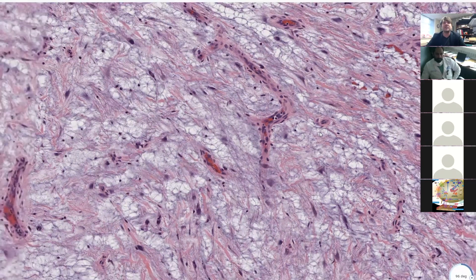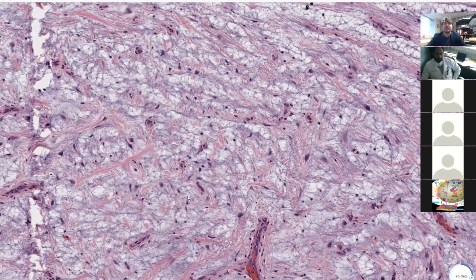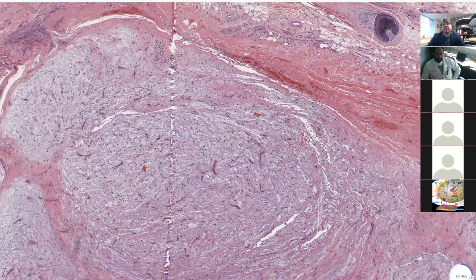But basically, the vessels in myxoid liposarcoma are branching, but they are super, super, super tiny. So much more thin than this. This is way too thick for the vessels of a myxoid liposarcoma. The myxoid liposarcoma vessels are basically one endothelial cell thick with a single layer of red cells that can fit in between. The other thing is myxoid liposarcoma is vanishingly rare in the skin.